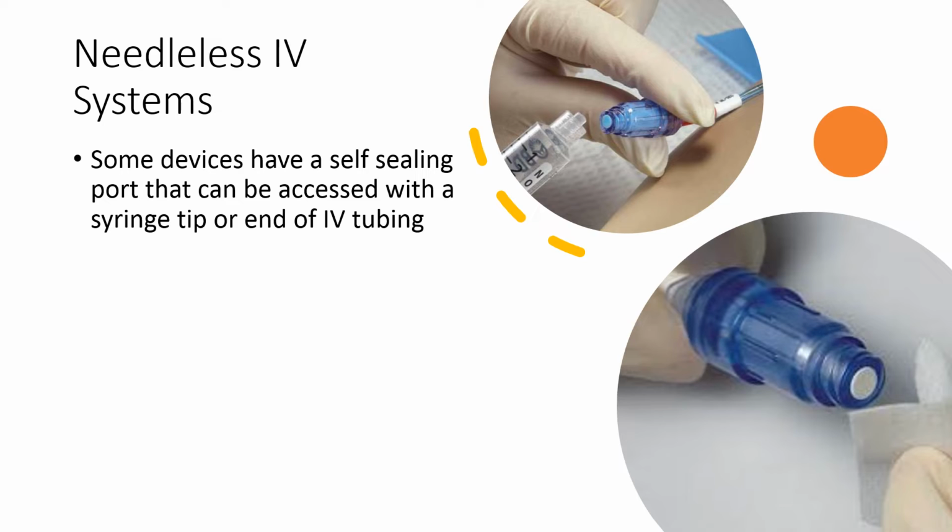And again, you really want to scrub very hard. A lot of times people will scrub around the whole thing. Really on the top, hard friction back and forth to really remove any microorganisms that may be on that port before you're inserting anything into it.